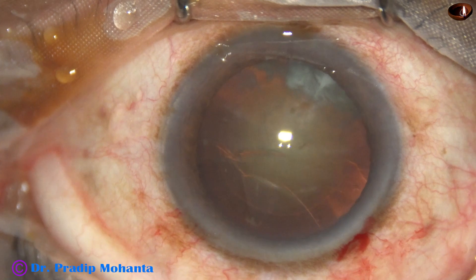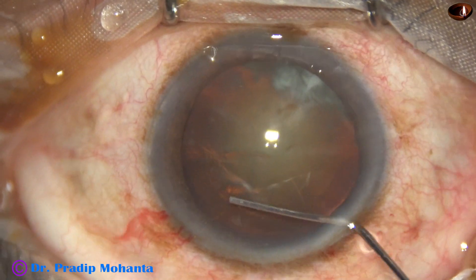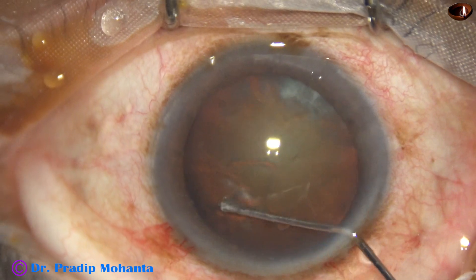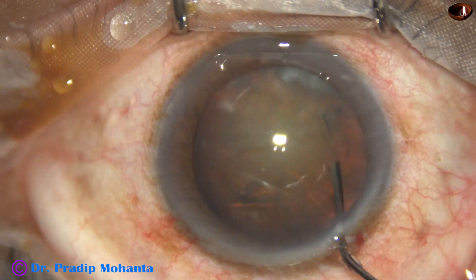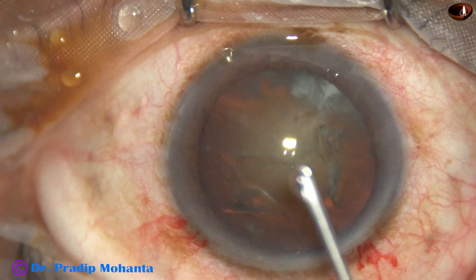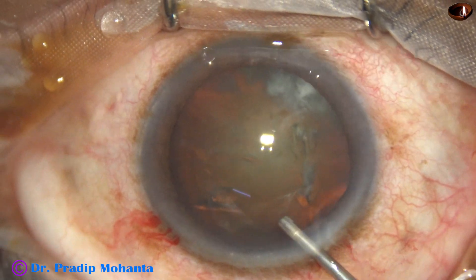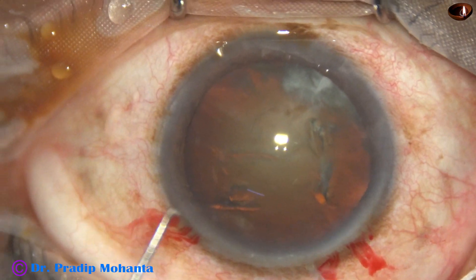Now hydrodissection is being done with a 27-gauge cannula. The nucleus is tapped, and the anterior chamber is again filled up with viscoelastic.